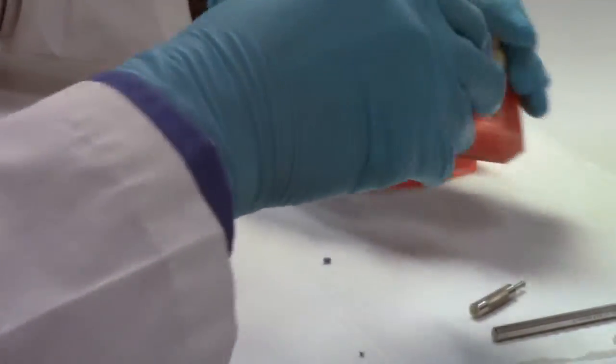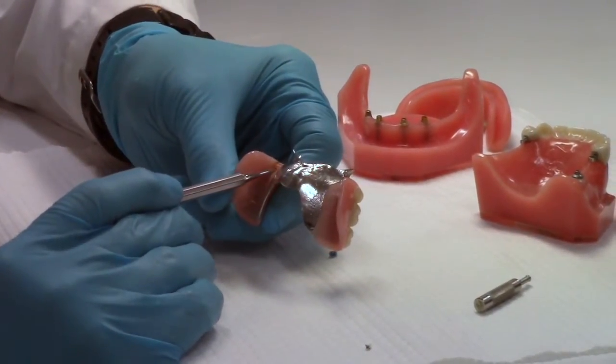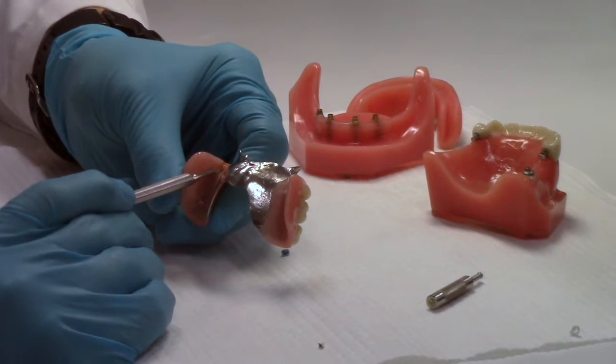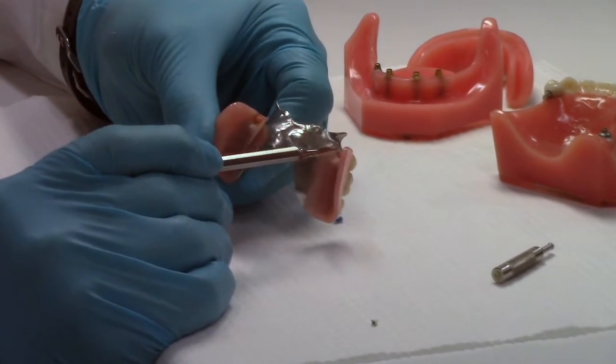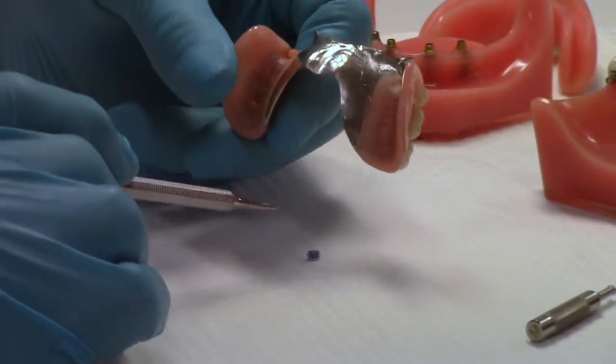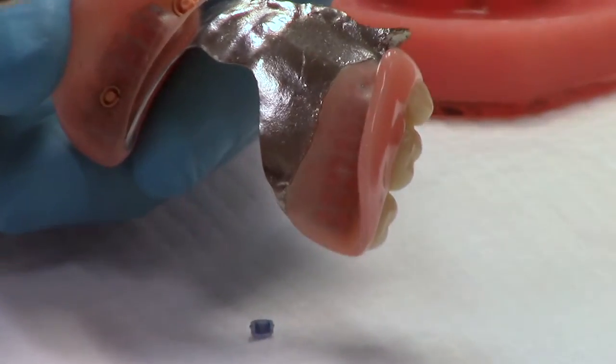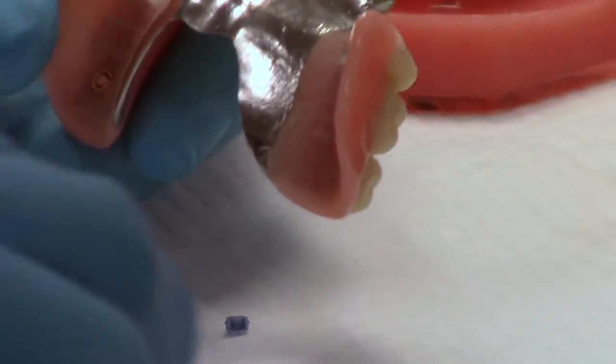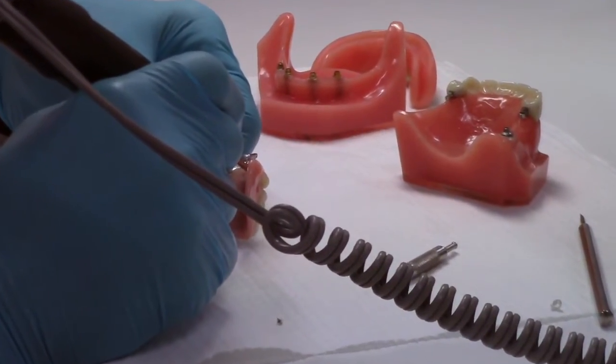Let me get this partial denture out. Now I happen to have the ERA RV over here, but on the other side, I'm going to change out this micro. Now I have an orange one here. The blue that I'm going to use is one step up in retention. The center button gets a little bit larger, but I thought you could see it a little better in the blue color. So once again, I've got my core cutter in place. I'm going to line it up. Medium speed.